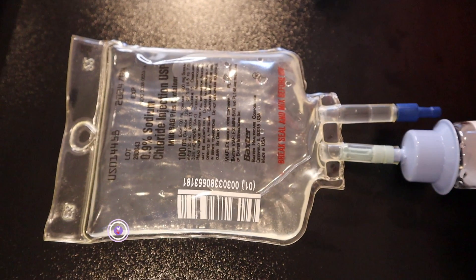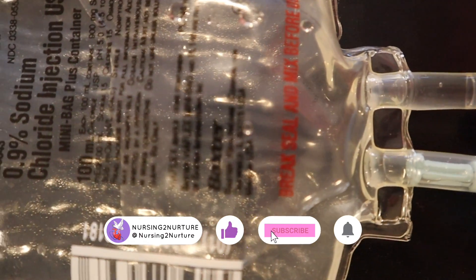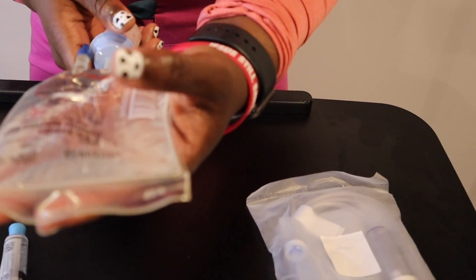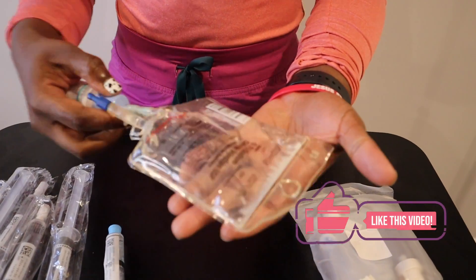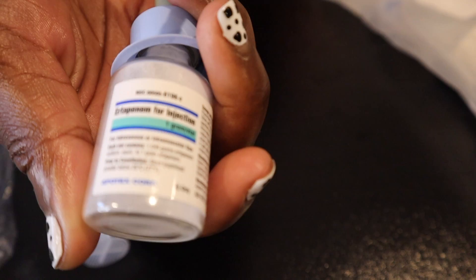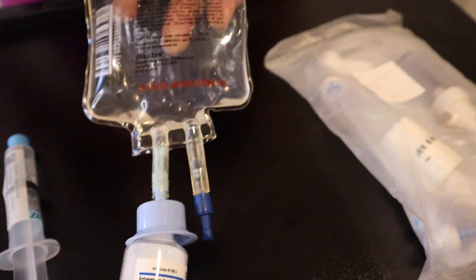Hey everyone, in today's video we are going to go over a quick demonstration on how to mix an IV mini bag plus. If you're not familiar with what an IV mini bag is, this is a 100 milliliter bag of IV fluids with a vial attached to it. The vial contains a medicated powder, some sort of medication, usually an antibiotic in most cases.